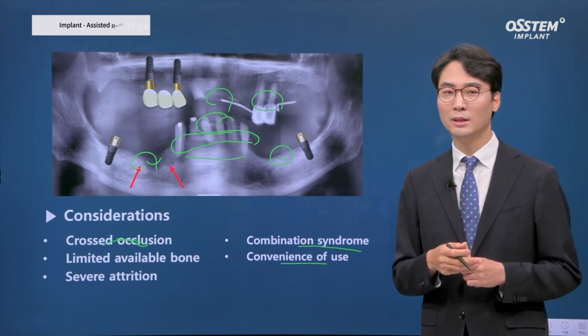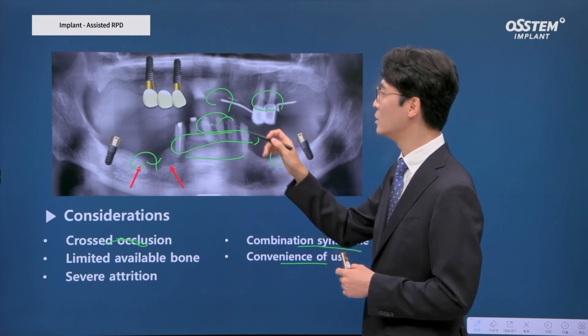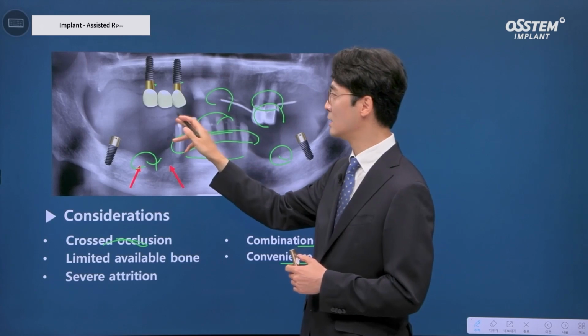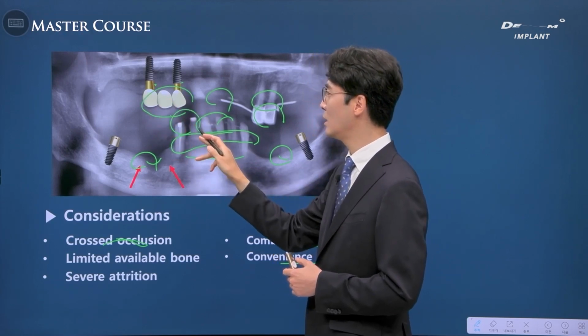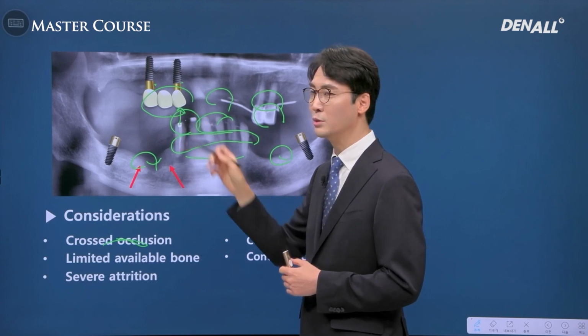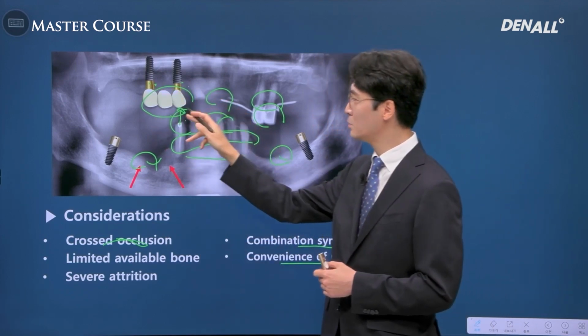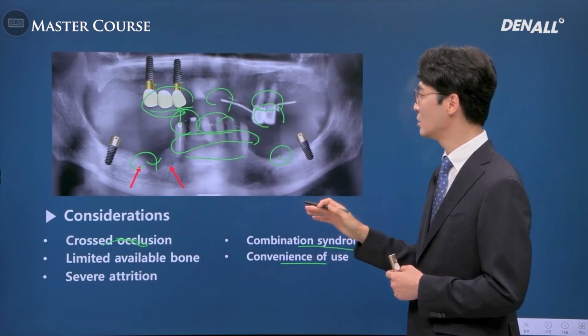In order to get maximum effect with minimum number of implants, in the case of the upper, with the help of insurance, 2 implants were to be placed in the upper right. In order to make a vertical stop in number 2 and 4, 2 implants were to be placed. A surveyed bridge was planned and IARPD was planned as well.